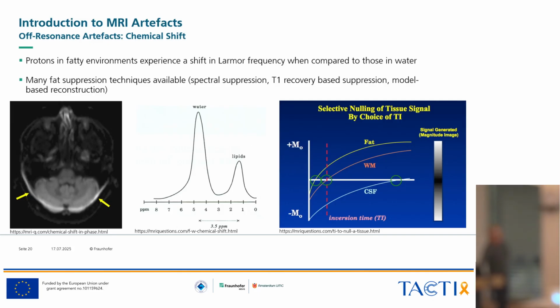So usually your whole system is tuned to the water protons, as this is usually what you want to measure, and this makes up the largest part of protons in your body, basically. But you also have those lipid protons, and they usually have a quite bright signal and fast relaxation time. So you should usually have them somehow in your images.